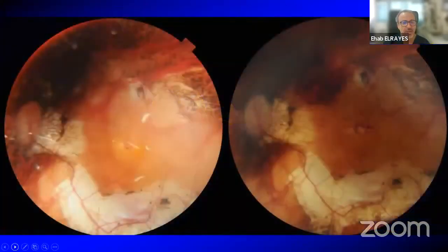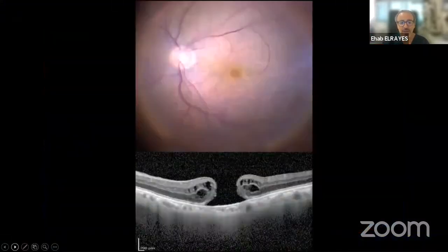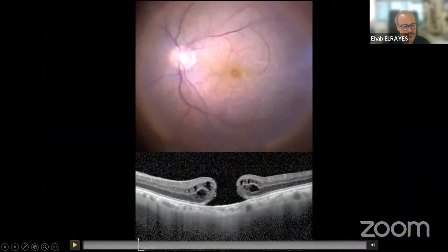is still there. Several patients: this patient was done under vitrectomy, ILM peeling, a flap under silicone, and still we got silicone trapped through the macular hole. We removed the silicone and we just put a buckle in that area, and you can see that the retina is flat again with no tamponade, just by using the macular buckle and an air bubble for 2 days after. Now, I showed you this patient here again.